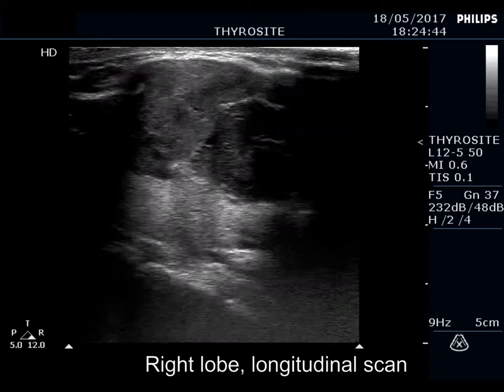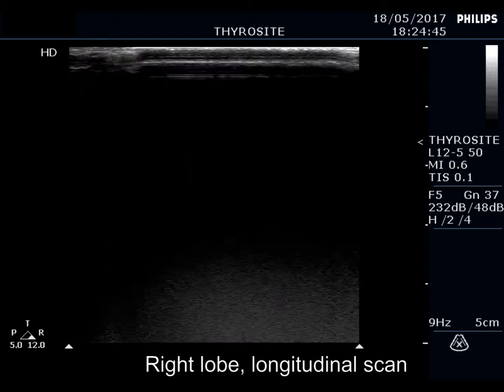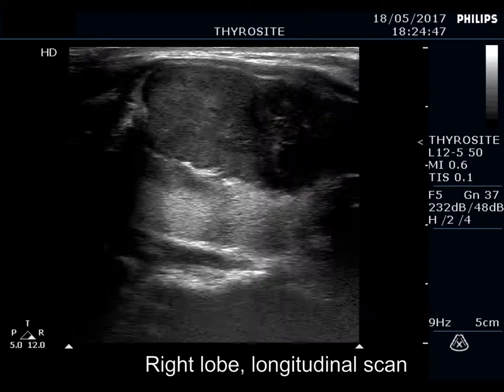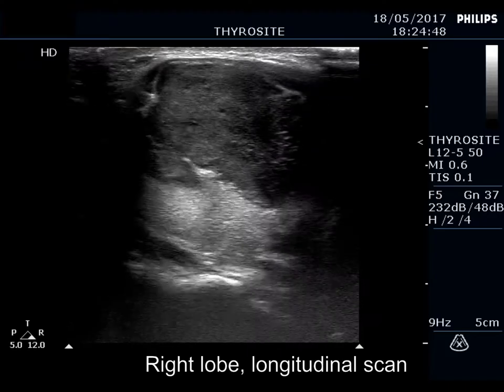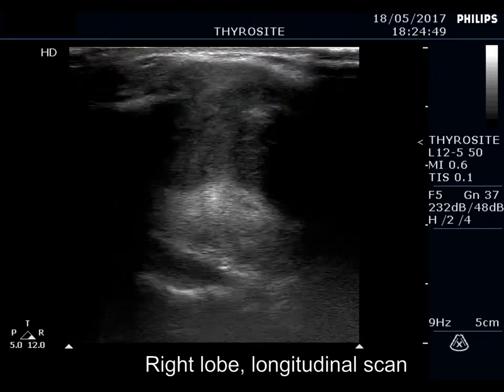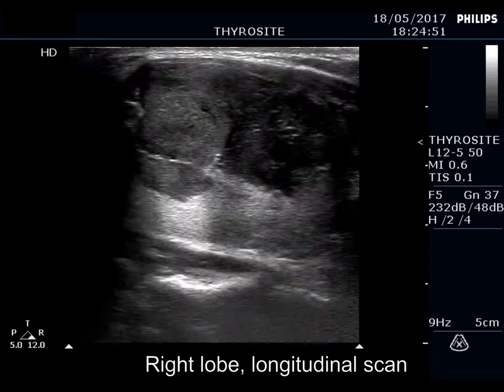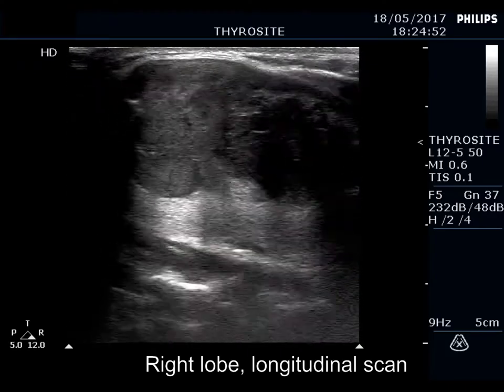The ventral borders of the mass and that of the lobe are not evident, but the contour of the mass clearly presents abutment. The capsule of the lobe is discontinuous.